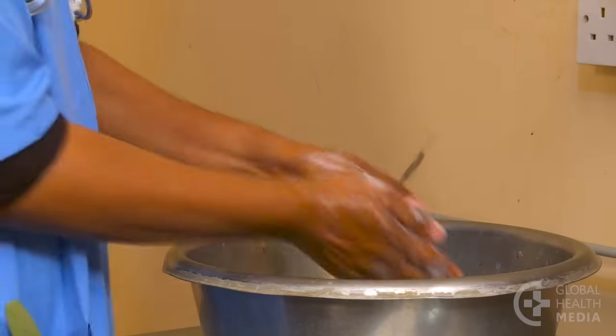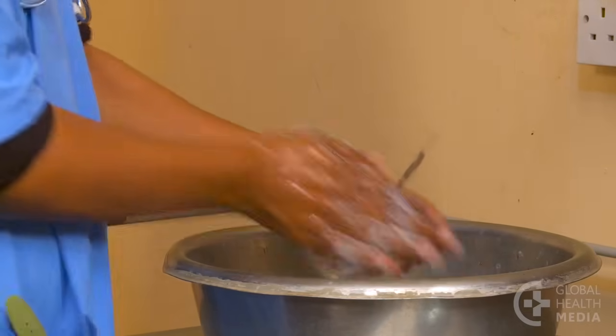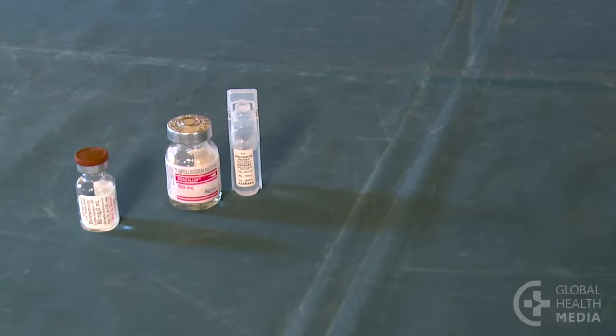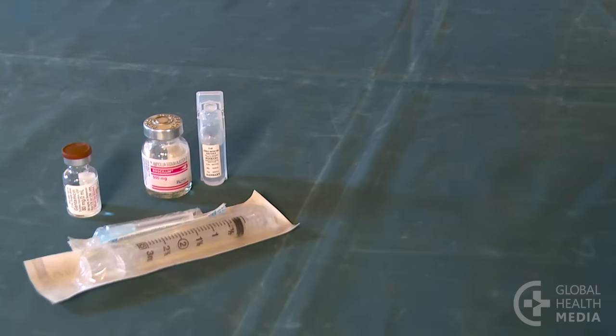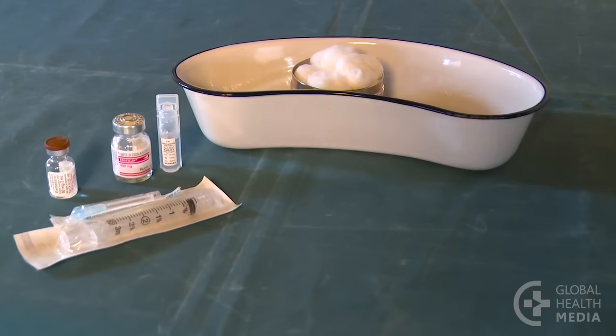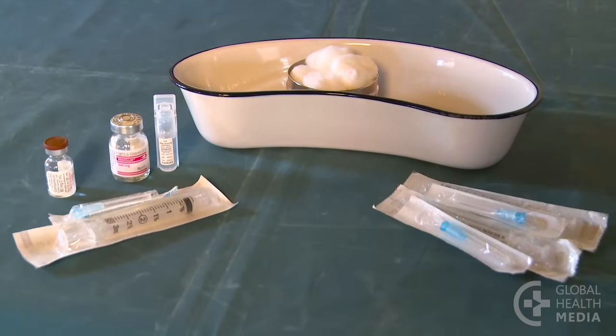Wash your hands, then gather your supplies: gentamicin, ampicillin and sterile water for injection, a sterile syringe and needle for mixing the ampicillin, cotton balls, and two smaller sterile needles and syringes to give the injections.